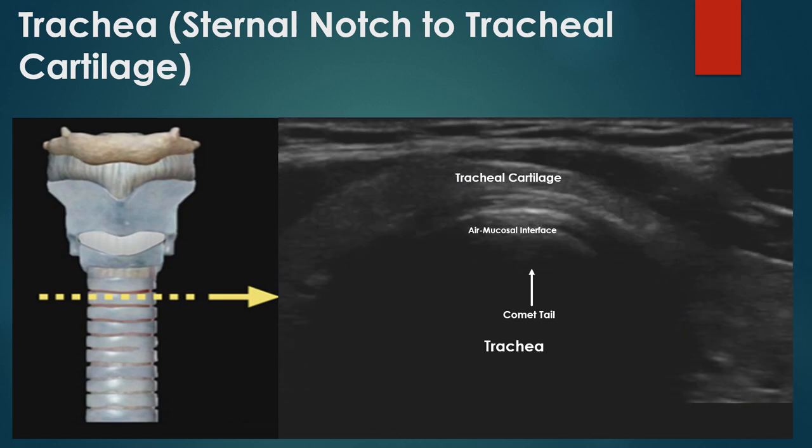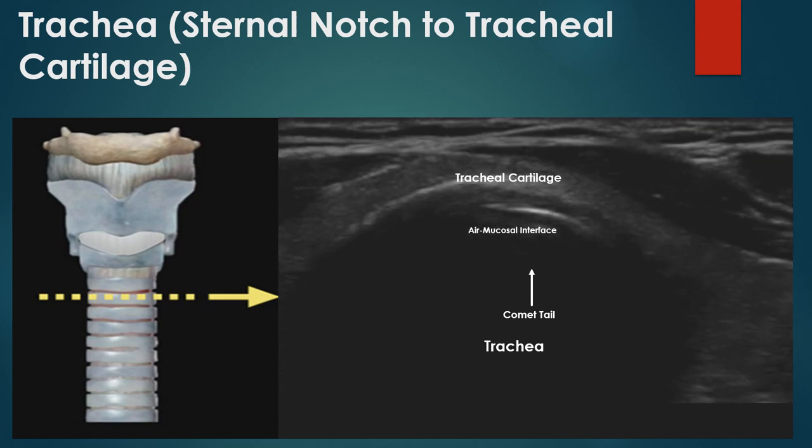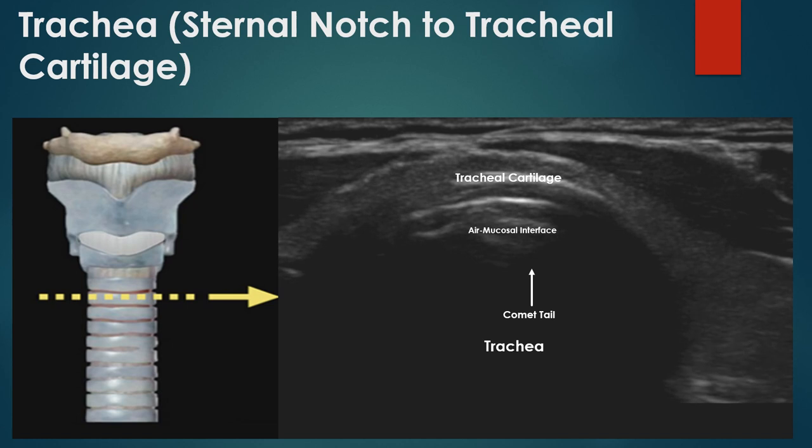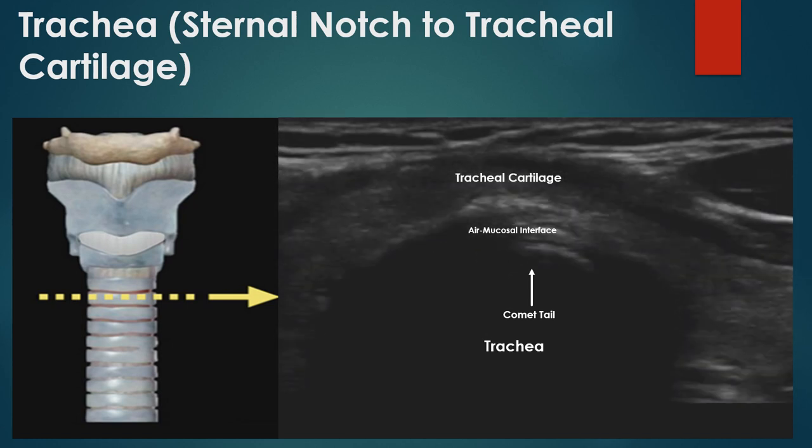Those of you that are used to doing a lot of ultrasound for your line placement are probably pretty familiar with a lot of what we're going to see here, especially as we start to get a little bit more cranial, especially as we start to find the esophagus.